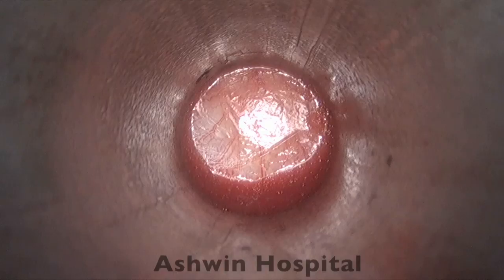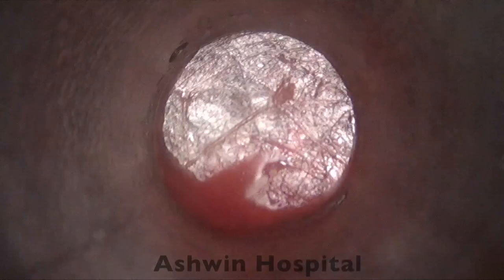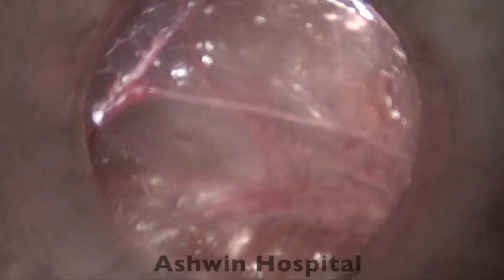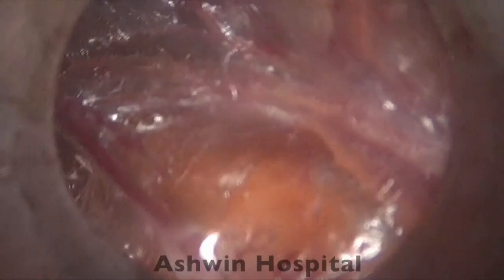We will start with the standard TEP repair. Generally, we should not go in the midline. We should enter to the right or left of the midline. So here we are entering into the right side, into the retrorectus space. That white sheath was the posterior rectus sheath. So now we have started the insufflation after making sure that the white sheath was seen posteriorly. And now as soon as the insufflation is started, you can see the cobweb appearance coming into the view. Once again, we see the white posterior rectus.